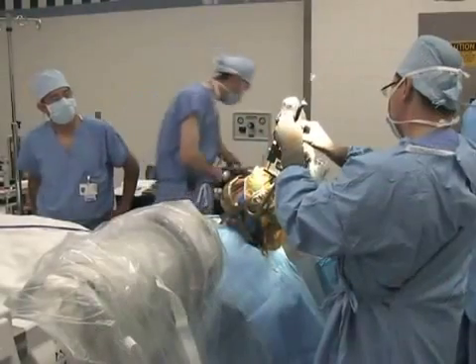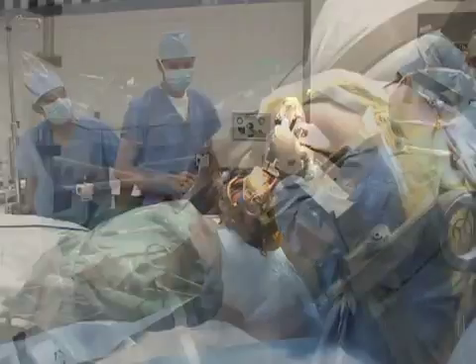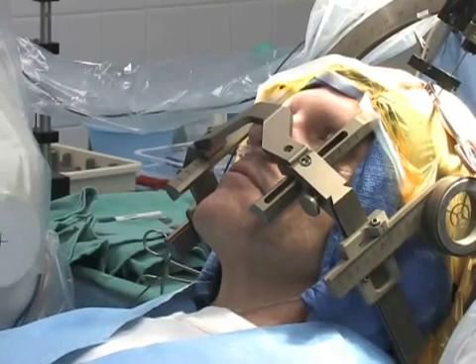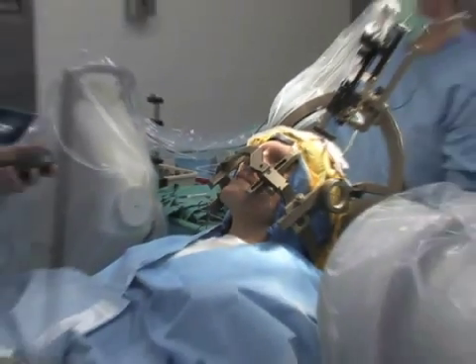Once the exact nerve cells are located, the recording electrode is replaced with the permanent DBS lead. Then test stimulation is performed. You will be asked to count numbers and tap your fingers, and you will be asked if you feel any tingling or if your symptoms lessen or go away.